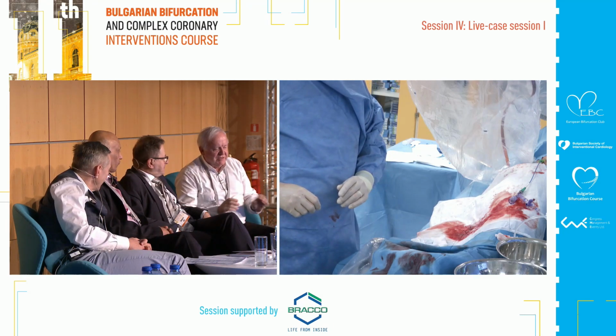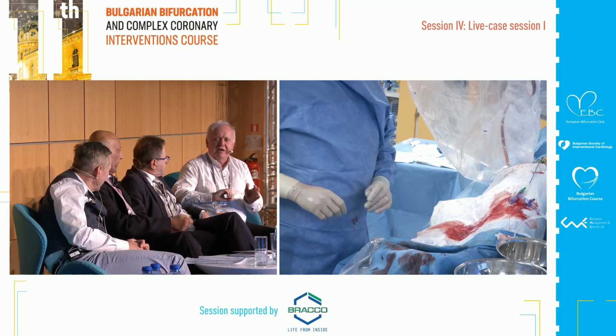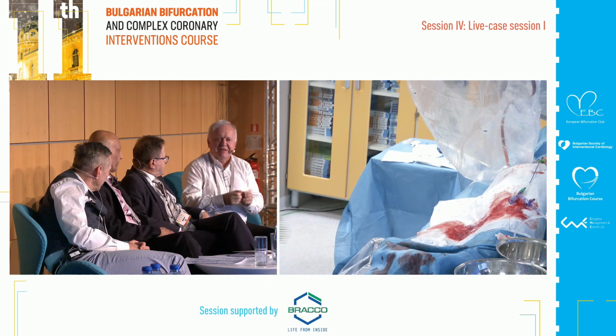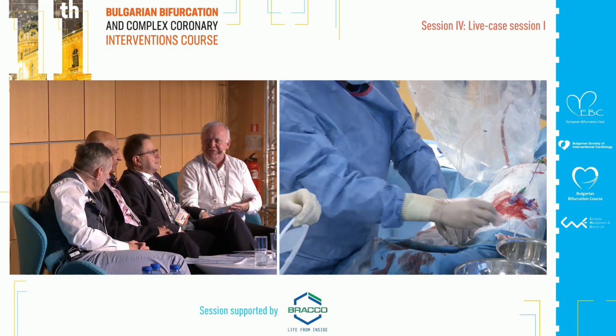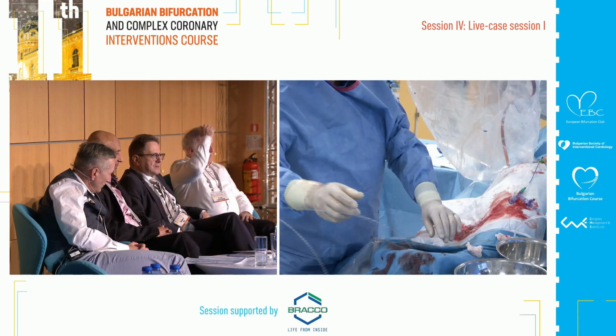What I don't like at all is when you didn't see long enough inflation by IVUS. I think you see some discrepancy. This is not the diameter, it was not open. Yeah. You have probably not distal enough. Yeah, repeat it by IVUS.